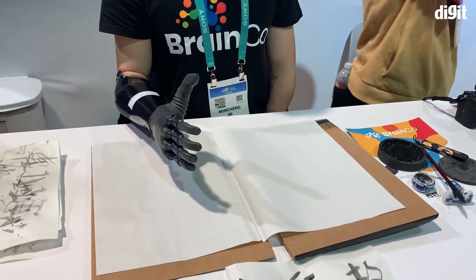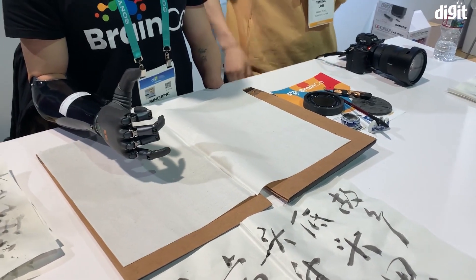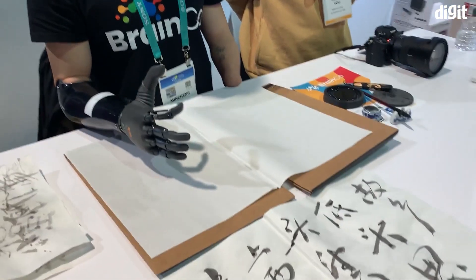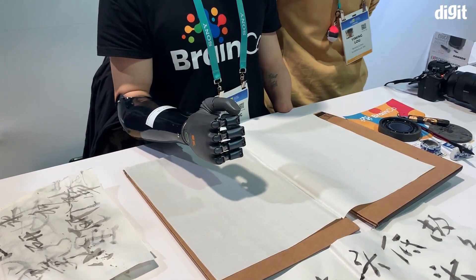Hey guys, welcome to Digit.in. As always at CES, we get to see a bunch of innovative technologies, and what we have here is a prosthetic arm for people that have lost their forearm. It is actually very cool to see how this controls.